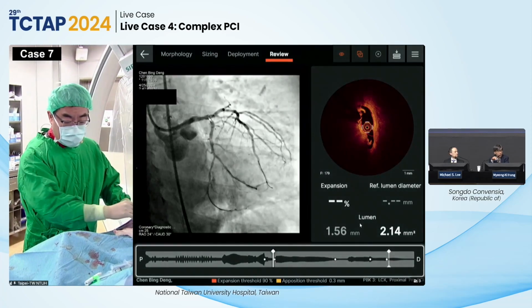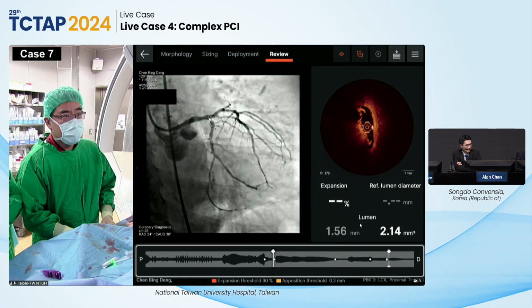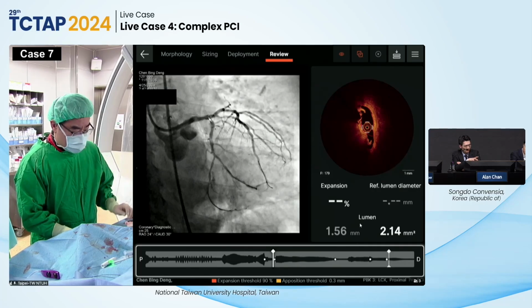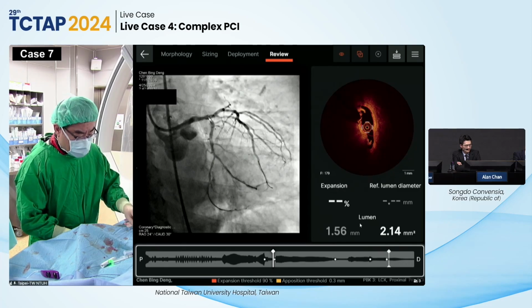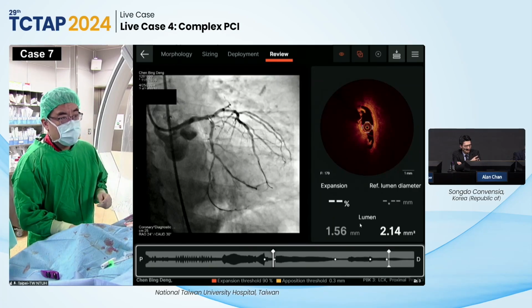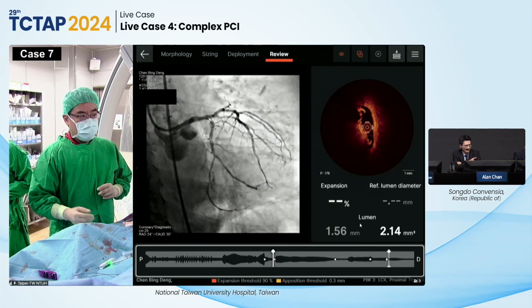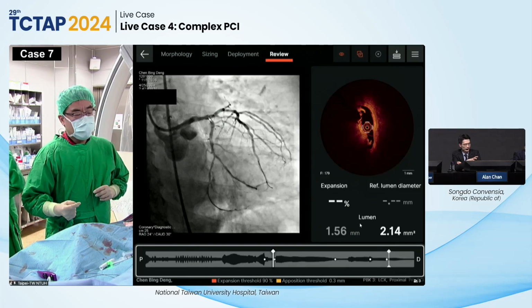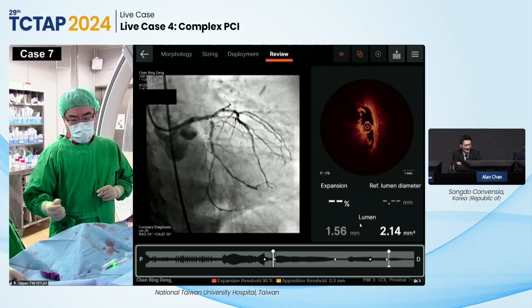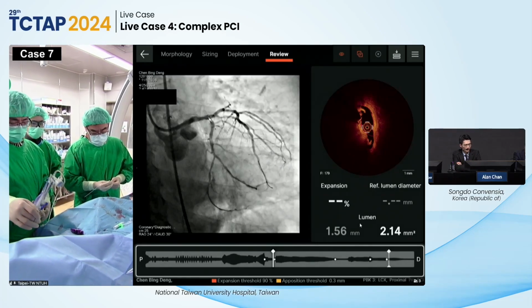Paul? Yes. From Hong Kong, it seems from the OCT and from the ballooning, there's a problem, even though you're using a scoring balloon. From the OCT and from the limited fluoroscopy, it seems the anatomy of the ostium circumflex has some kind of eccentric calcification, whereas you can always do a balloon dilatation under stent boost and then confirm. Very likely the behavior for this particular anatomy is more like an eccentric calcification, and for that aspect, probably a provisional stenting may be a bit challenging because of the angle together with the calcium, or already a lot of dissections.